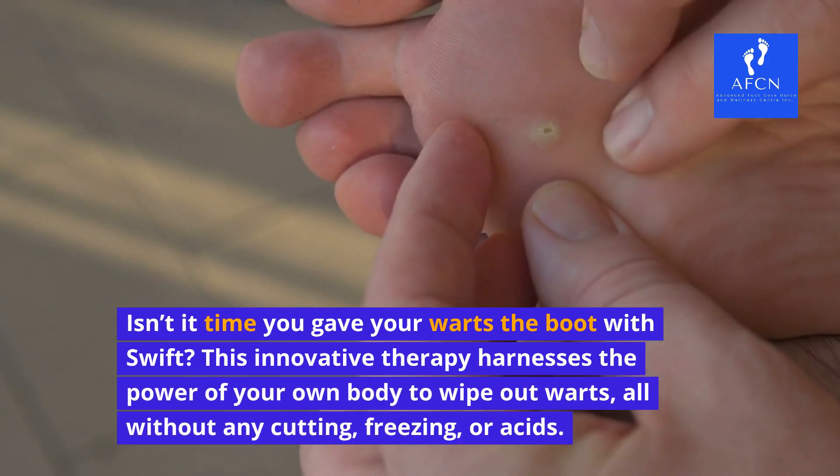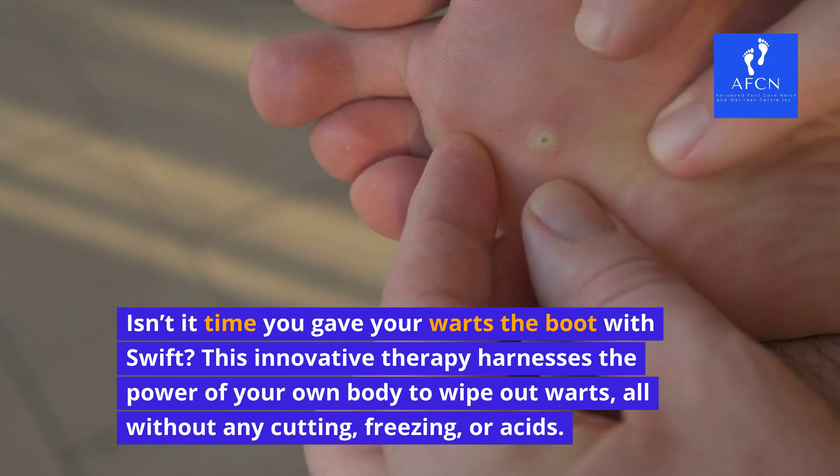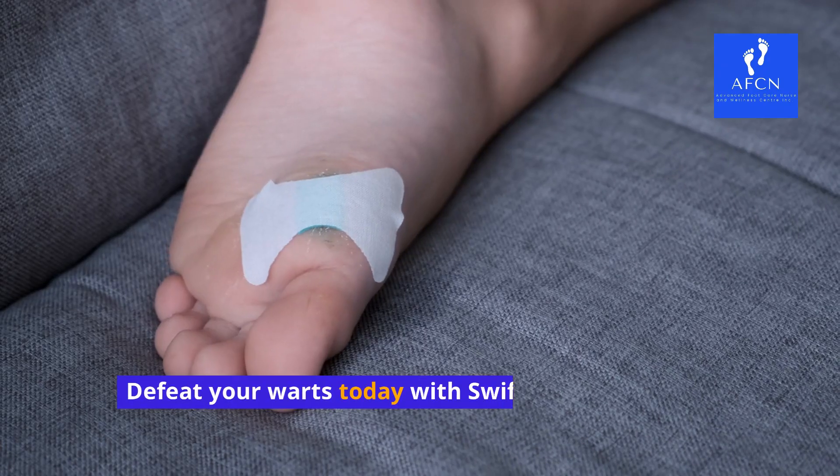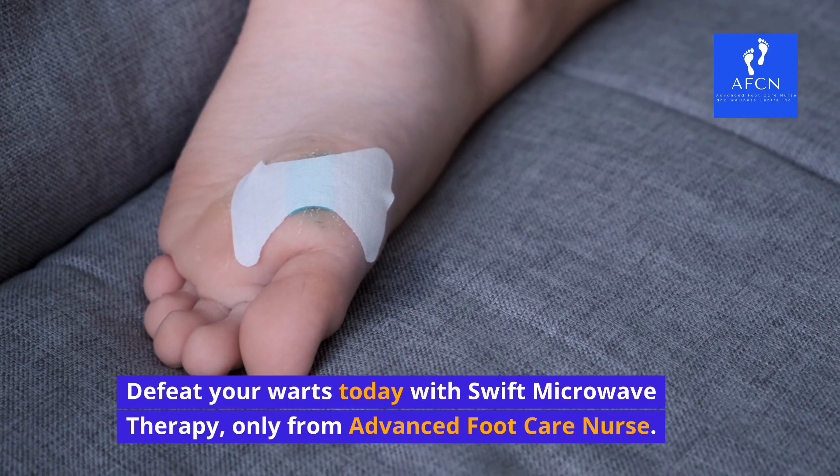This innovative therapy harnesses the power of your own body to wipe out warts, all without any cutting, freezing, or acids. Defeat your warts today with Swift Microwave Therapy, only from Advanced Foot Care Nurse.